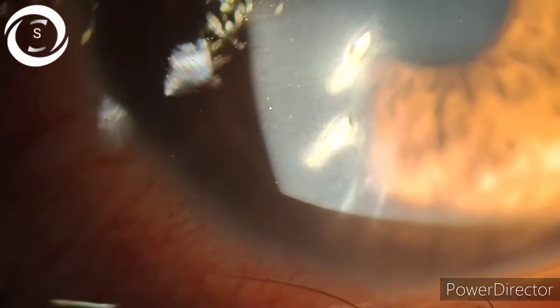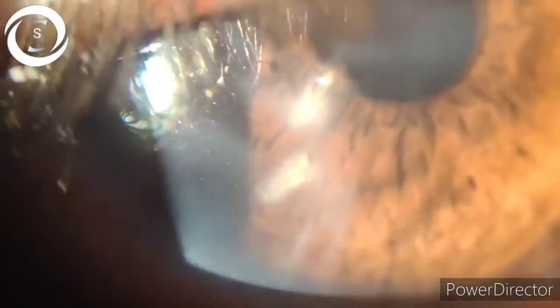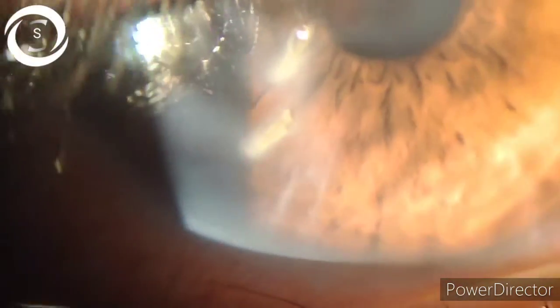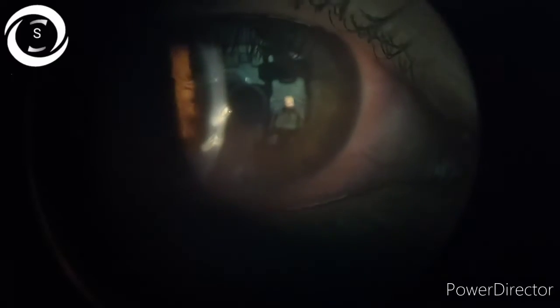When I examined him on slit lamp after installation of topical anesthetic, you can clearly see two parallel vegetative foreign bodies deeply embedded in the corneal stroma. Their course is oblique. You can see on corneal cross section that they are through and through the corneal stroma, and maybe some part of the foreign body is in the anterior chamber.